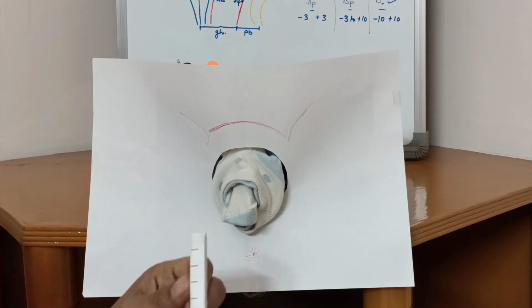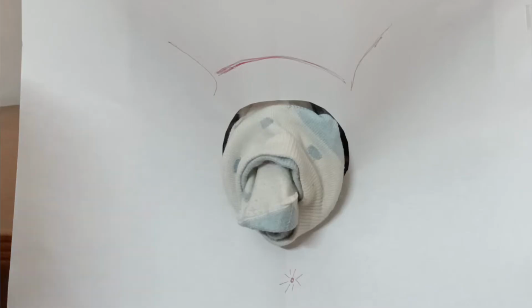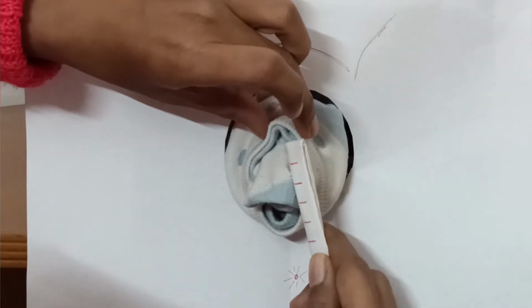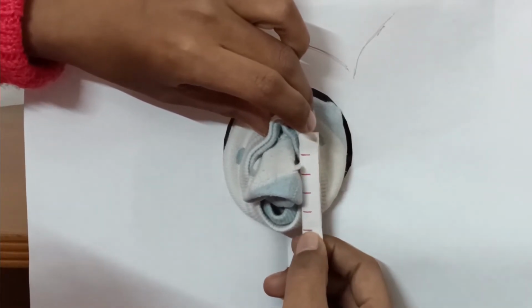You require 1 centimeter markings on it for the measurements. Now let's quickly begin with the measurement. First we measure the genital hiatus, which is from the mid-urethral point to the posterior hymenal ring or the fourchette. Over here we have our urethra, you can see the red dot inside, and from that to the posterior hymenal ring.